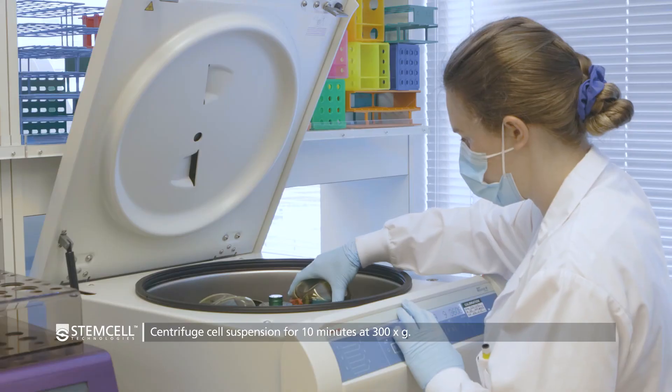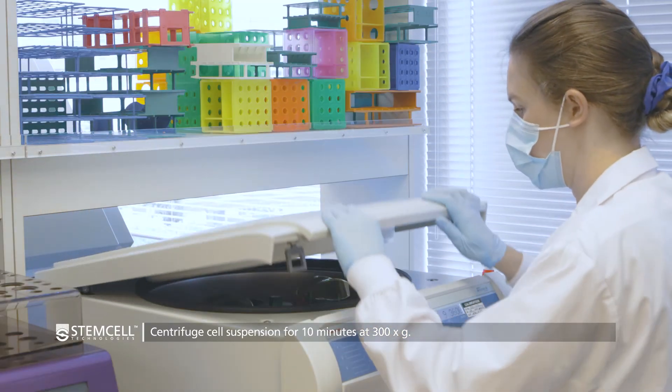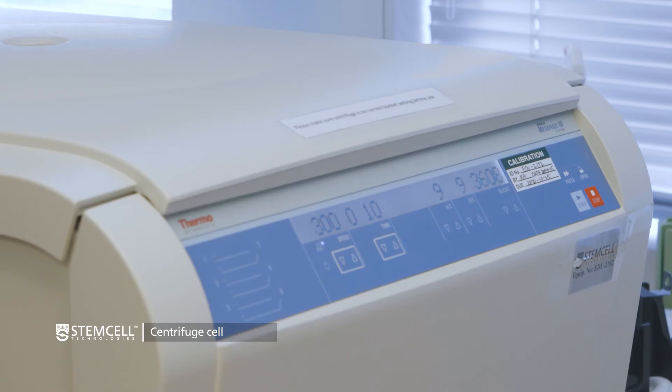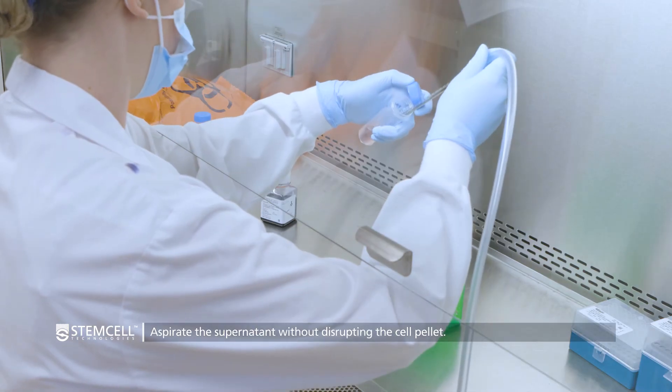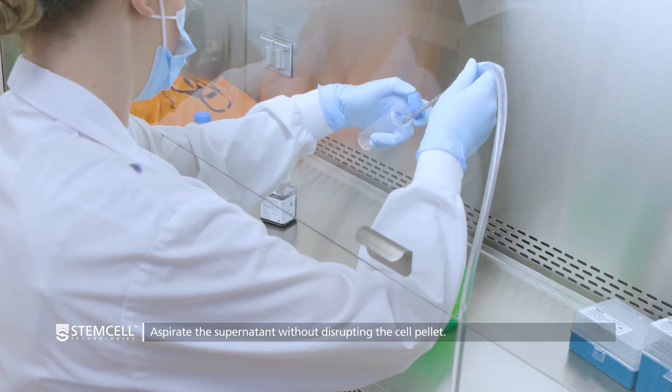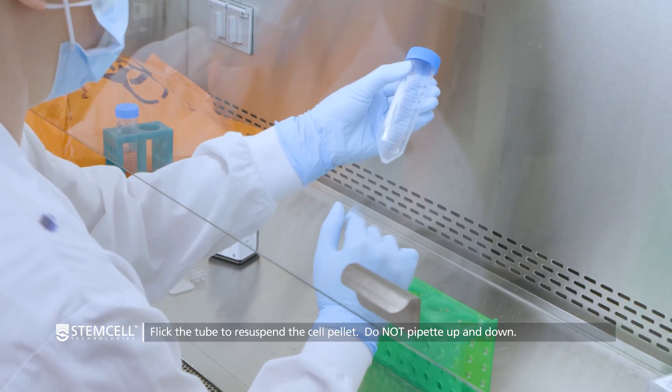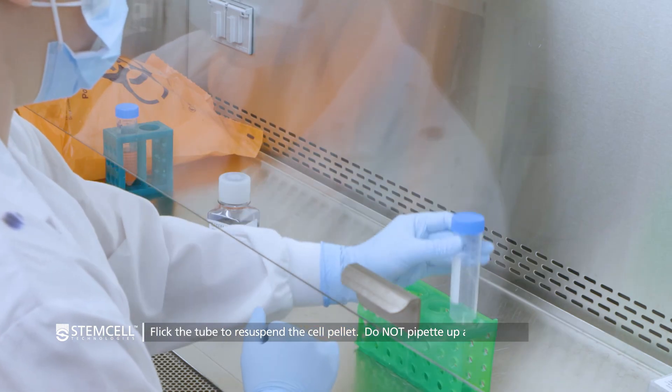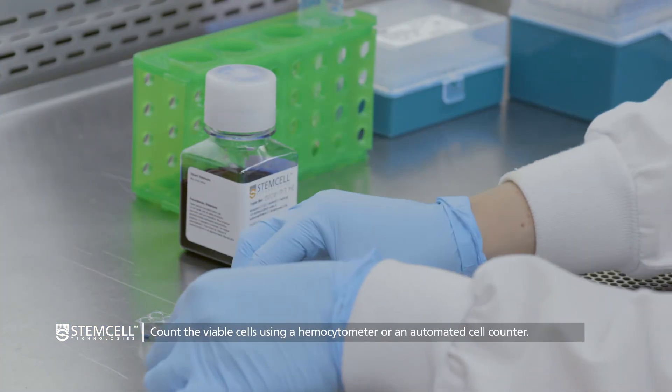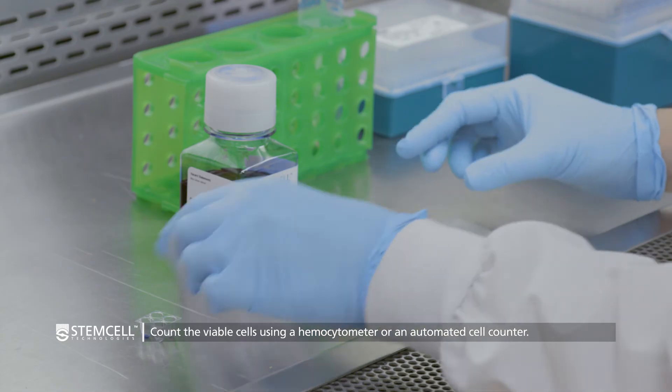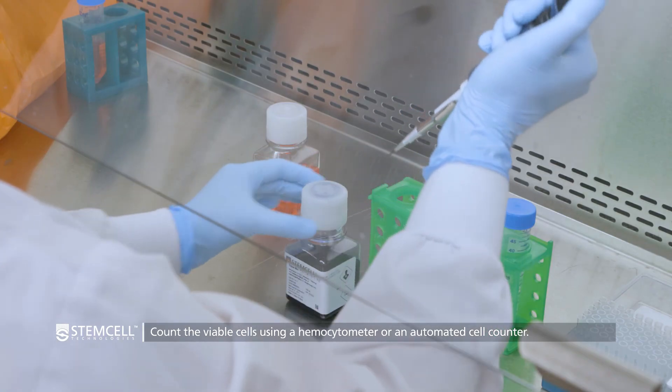Centrifuge the cell suspension for 10 minutes at 300 times G. Aspirate the supernatant without disrupting the cell pellet. Flick the tube to re-suspend the cell pellet. Do not pipette up and down. Count the viable cells using a hemocytometer or an automated cell counter.